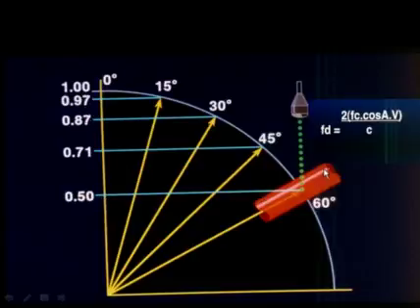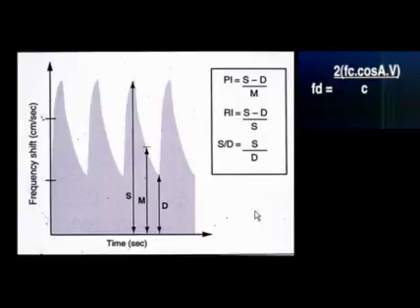Now, with our machines, we can either underestimate the blood velocity, or we can also overestimate the blood velocity when we use an angle corrector. In practical terms, it is not always easy to get an angle of 0 degrees, and that is the reason why, when we do Doppler ultrasound of the fetus, often we use indices which are angle independent.